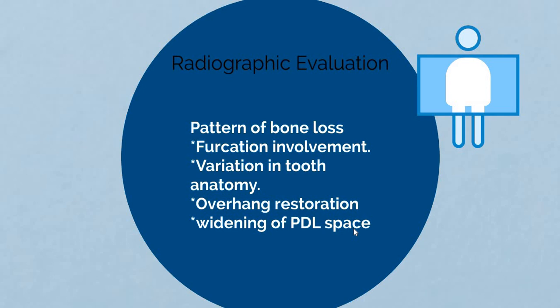In the posterior segment, vertical bite wings are often a useful supplement if a panoramic view suggests bone loss localized to this region. So sometimes the OPG is aided with the bite wing, especially when you have a bone loss, alveolar crest bone loss.